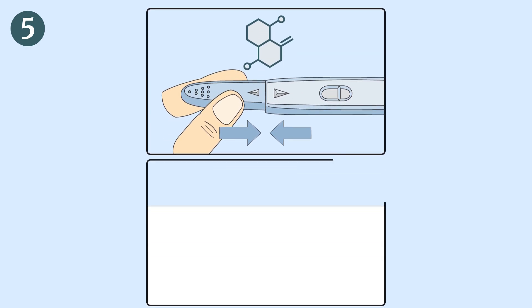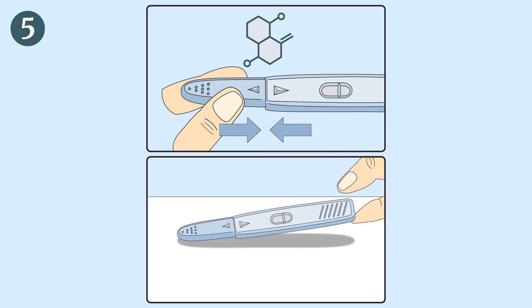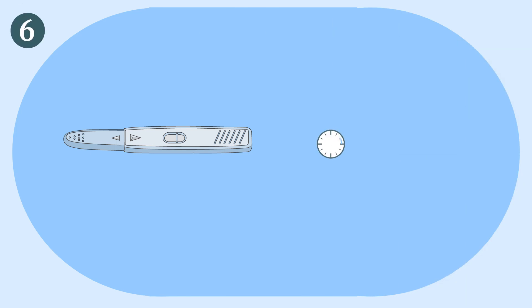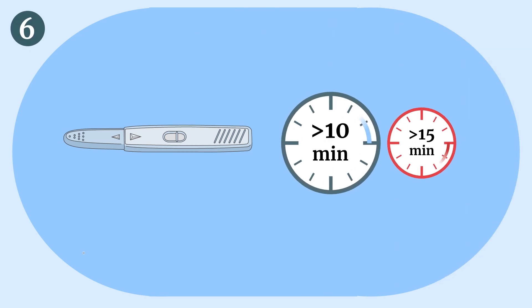Place the MenoCheck test device on a dry flat surface with the window facing up. Read the results after 10 minutes. Do not interpret after 15 minutes.